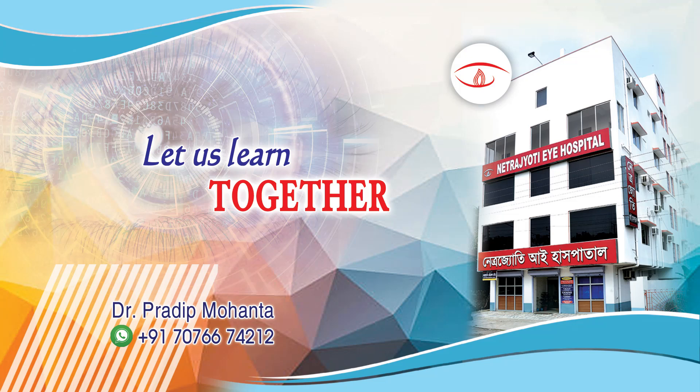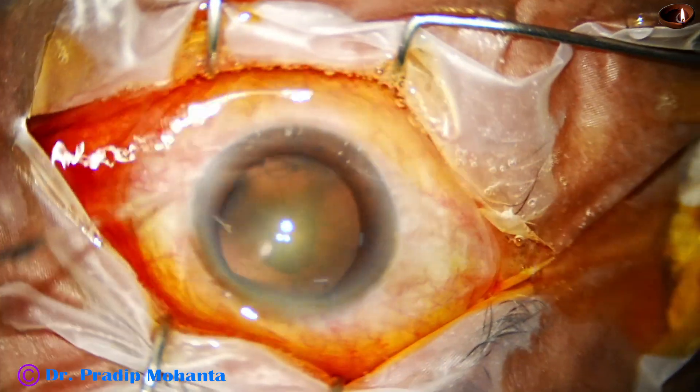Friends, welcome to my workplace at Ranaghat, West Bengal, India. Let us observe this totally unedited surgery.